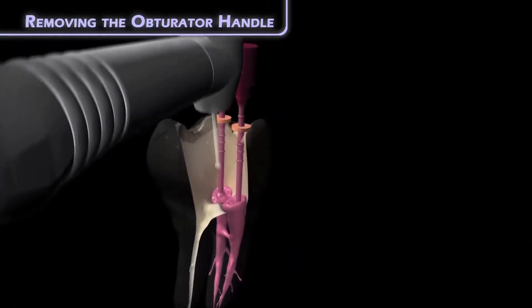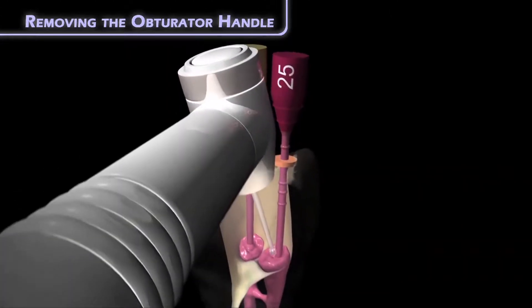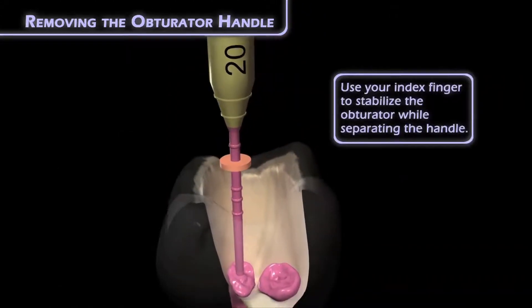If you wish, you may also use high-speed or slow-speed burrs for this step, but I found that there's no need to use these.